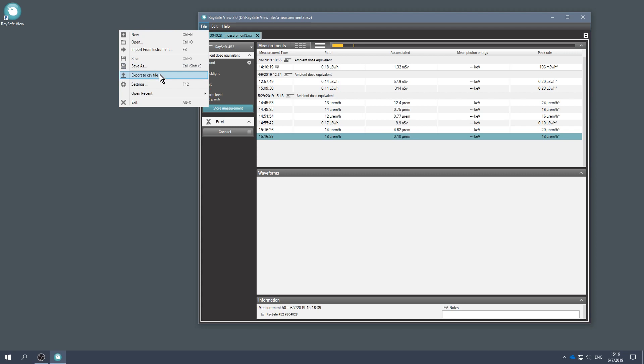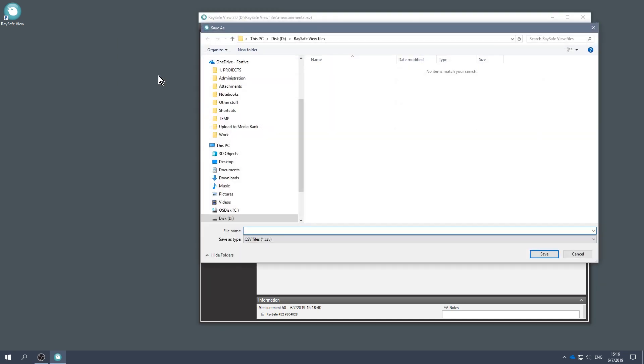If you want to analyze data with another tool, you can save a CSV file. CSV stands for Comma Separated Values.